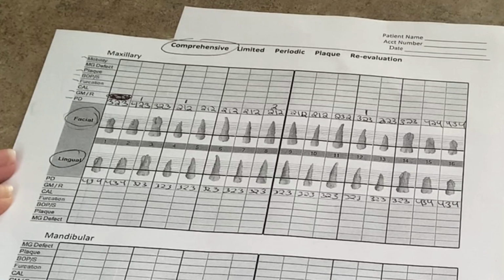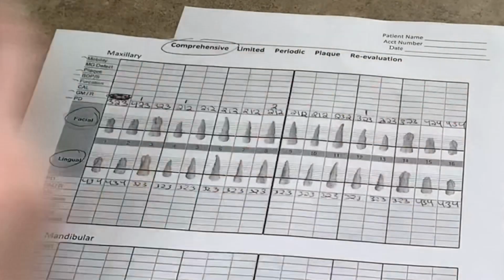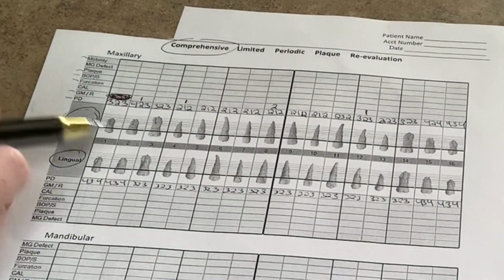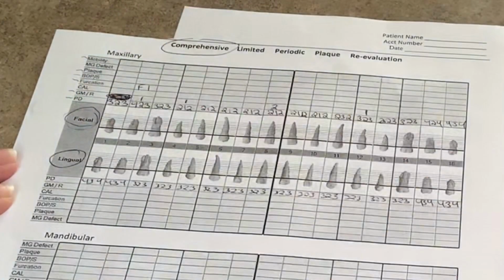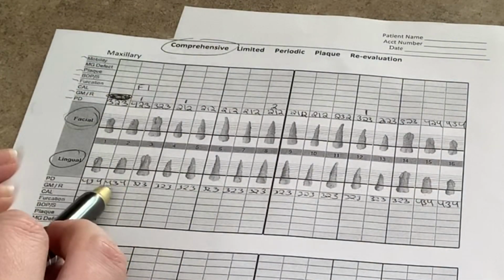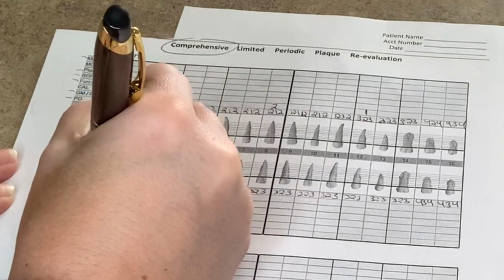So now we're going to move on to furcation. So again, remember from the video that the facials are going to have 1 reading, and the lingual only on the upper molars will have 2 readings because of the 3 roots. And the readings are usually F1 through F4.